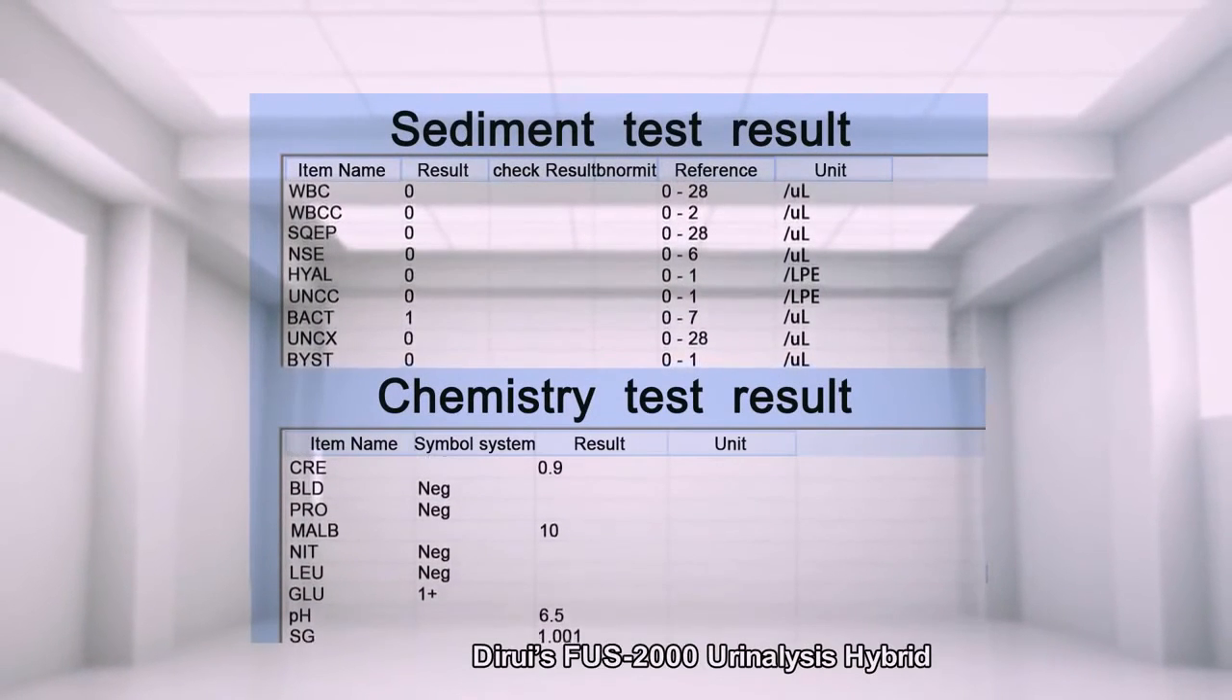Standardized test system. Dirui's FUS-2000 urinalysis hybrid meets the requirements of ISO 15189 with integrated and standardized test reports, as well as control and calibration records. Test items include 12 categories of urine sediment elements, plus 14 urine dry chemistry parameters, and 3 physical analysis items.